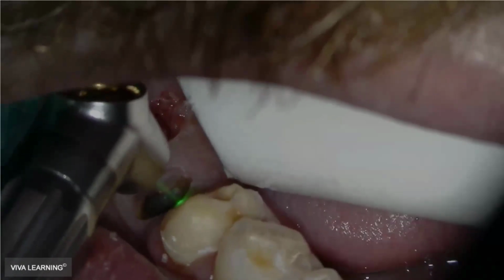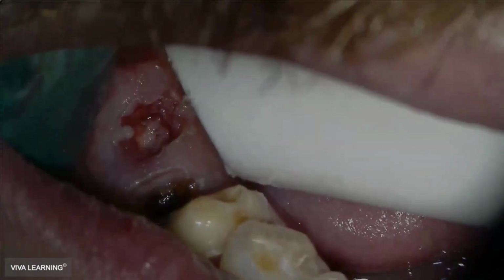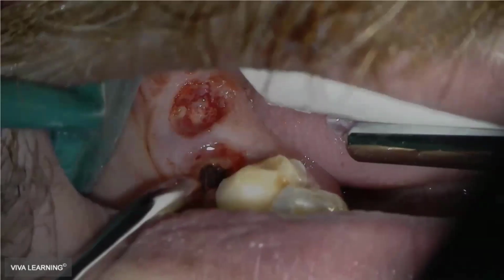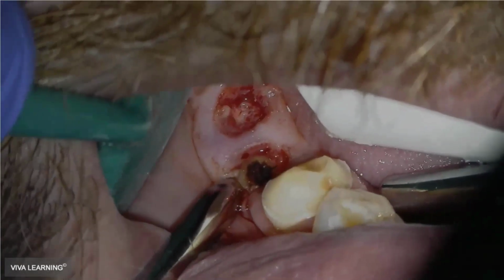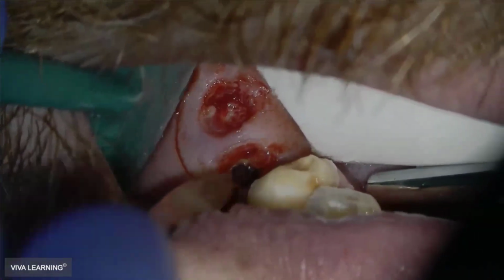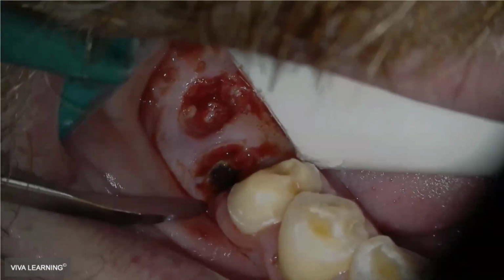Back to that previous one: is there any concern that you may damage the tooth when doing a lower frenectomy? To answer that question more simply, Ryan, basically don't point it at it. You have absolute control. You follow that aiming beam.